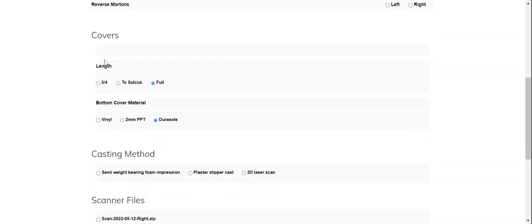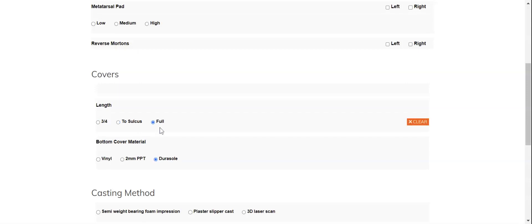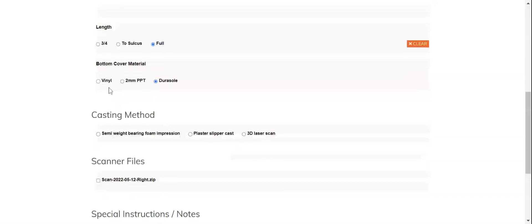You do not have an option to change the backing layer or the top cover with the standard view, but you can select a different length if you'd prefer it to be a three-quarter length cover that ends just proximal to the metatarsal heads, or sulcus length which is just distal to the metatarsal heads, or a full length which is of course to toes. You can choose a different bottom cover material or delete it entirely if you'd like.